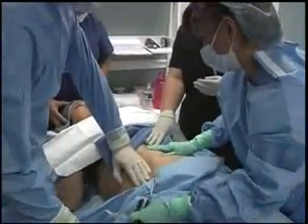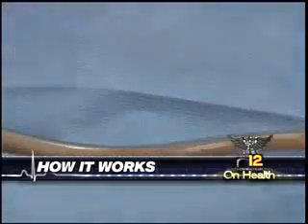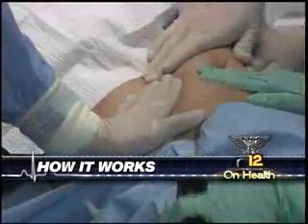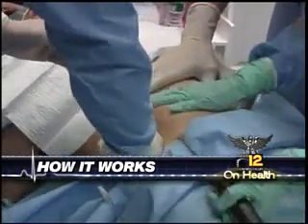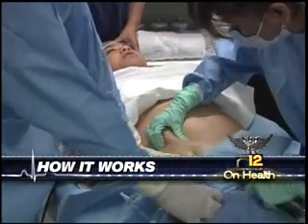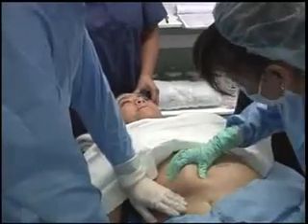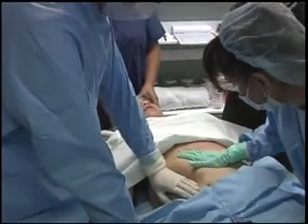So I want to show folks inside while you're doing it. It's a little graphic to someone who's never seen anything like this before, but less graphic than traditional lipo because it's not as violent a motion. Describe how this differs from traditional lipo. Well, laser lipolysis is another term for SmartLipo. It's a very, very small laser fiber. It's different from traditional lipo because it's not under general anesthesia. You go right through the skin where the fat layer is, and you simply melt the fat away without any invasiveness. So you send the probe, which is a cannula, in.